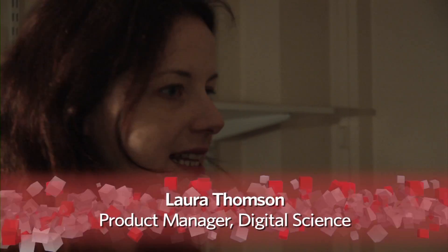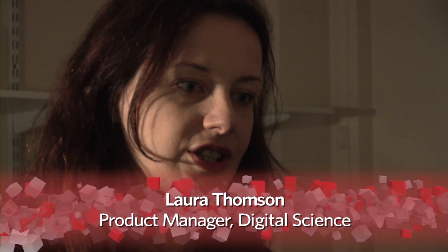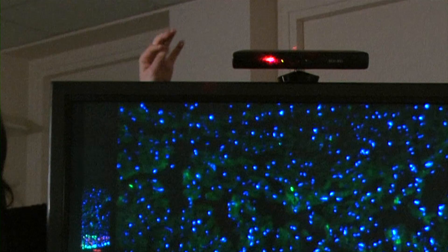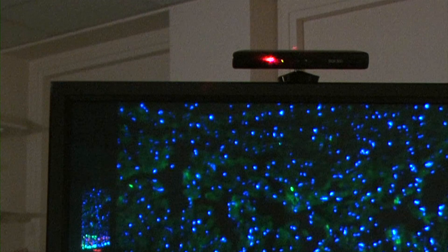What I've brought to show you today is some software that Digital Science are developing. It uses the Connect module that you get for a games console, and what it does is it allows you to view your images in sequence without actually touching anything, just using movement.